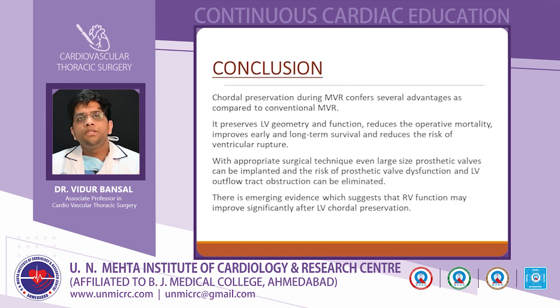So coming on to the conclusion, the chordal preservation during mitral valve replacement confers several advantages as compared to the conventional mitral valve replacement where there is no preservation of any chordae. It preserves the left ventricular geometry and function, reduces the operative mortality, improves early and long-term survival, and reduces the risk of ventricular rupture. With appropriate surgical techniques, even larger size prosthetic valves can be implanted, and the risk of prosthetic valve dysfunction and left ventricular outflow tract obstruction can be eliminated. There is emerging evidence that suggests that right ventricular function may improve significantly after left ventricular chordal preservation.